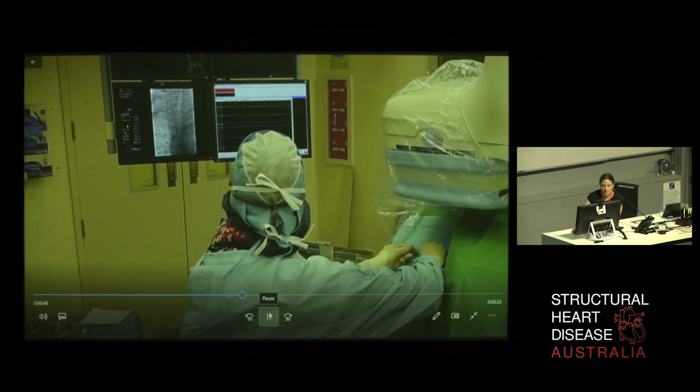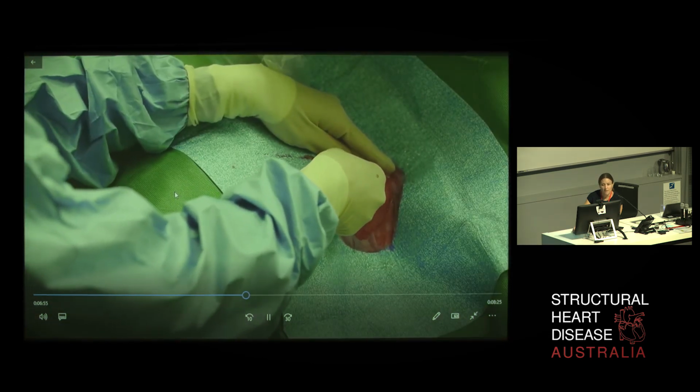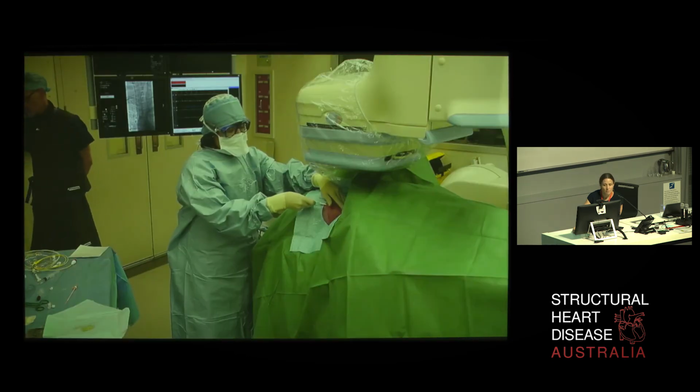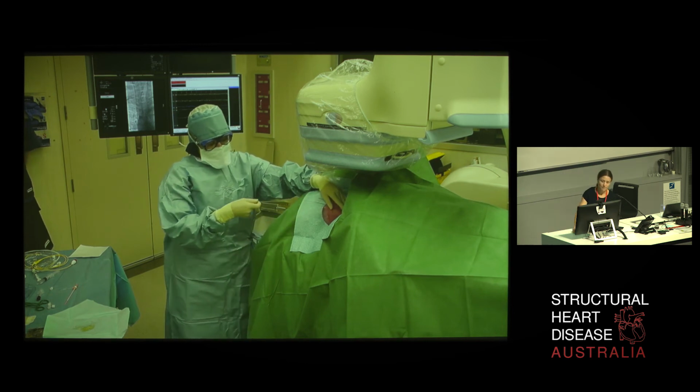With the sheath and then pass through. You see it passing down there into the right atrium, and I can tell it's nicely in there. So then I'm happy. I image that, not everyone does. I'm happy with the wire before I want to put in the sheath. Fluoroscopy in the right atrium.